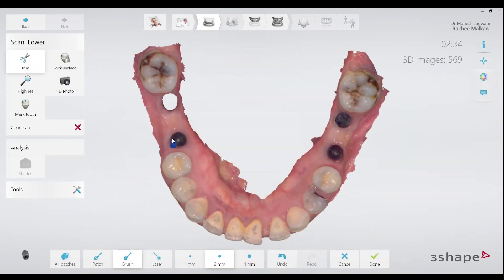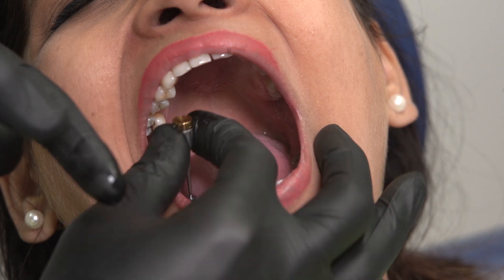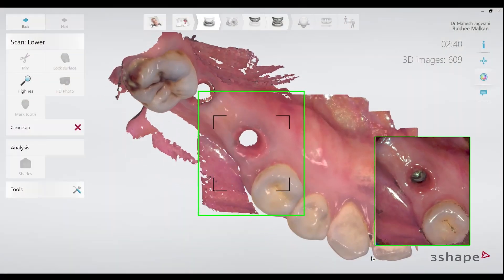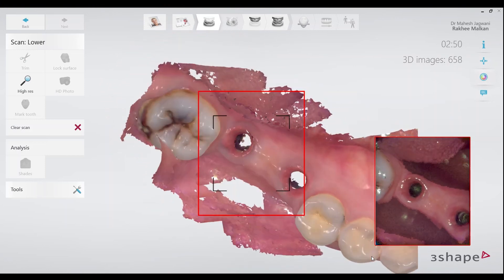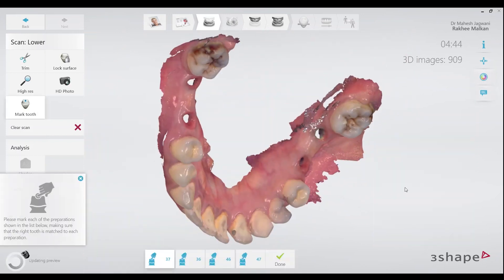I can then choose the trim tool to cut the healing abutments out of the scans. After this, the healing abutments are removed using the hex driver and the emergence profiles are recorded in the same scan. This will give the technician a great deal of information about the soft tissue emergence for this case. I do this on both sides so that all 4 implant emergence profiles can be scanned.